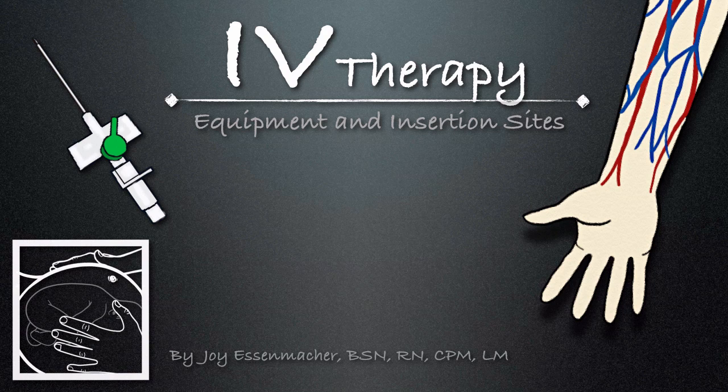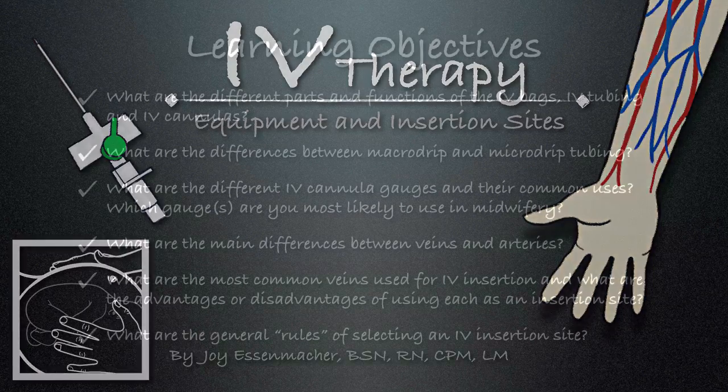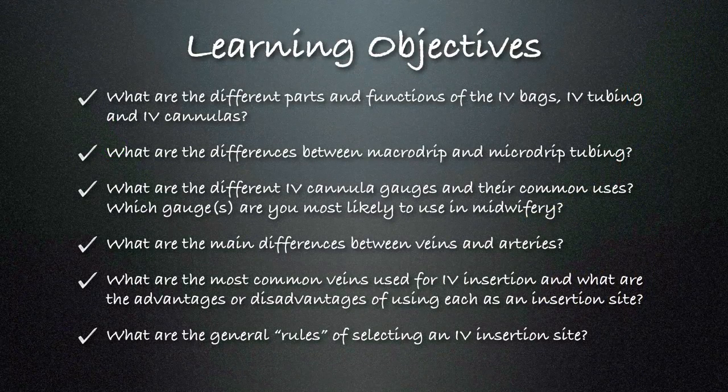Before we take a look at IV insertion, we have to spend a little bit of time talking about both IV equipment and IV insertion sites. These are the learning objectives that will be covered within this video.